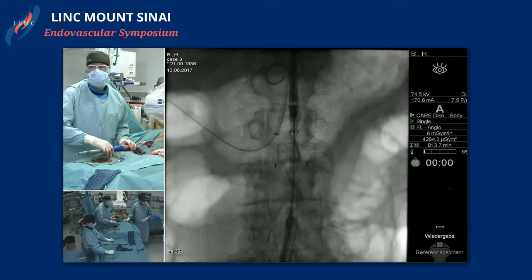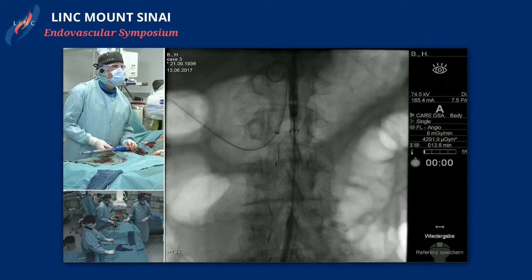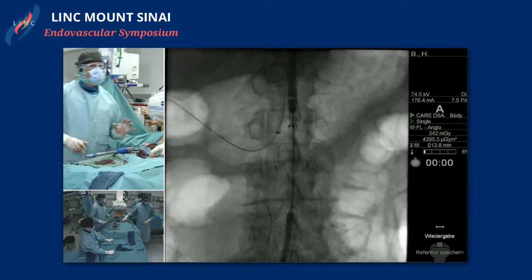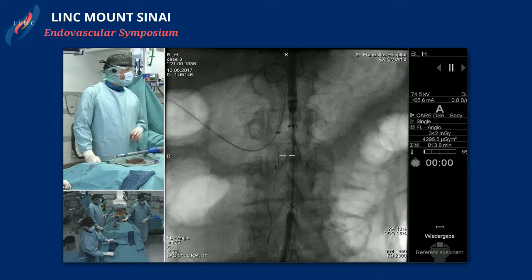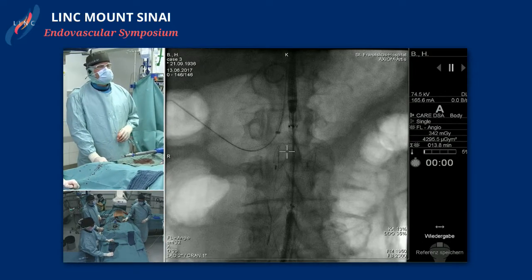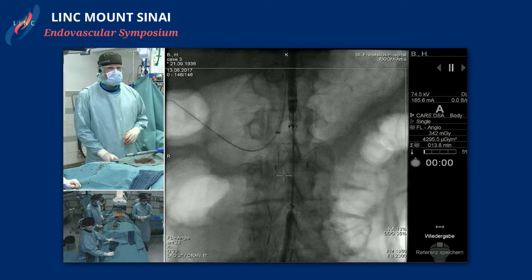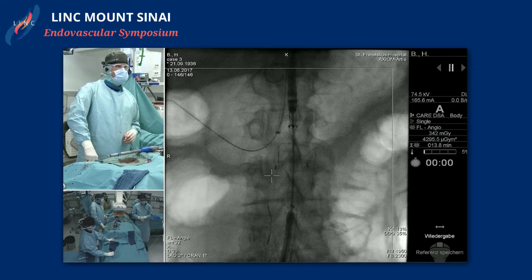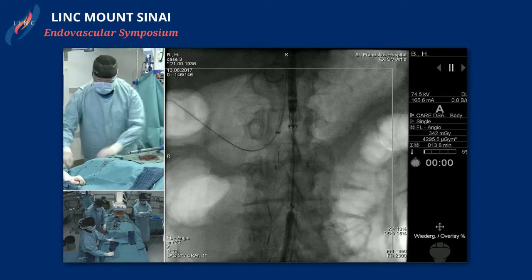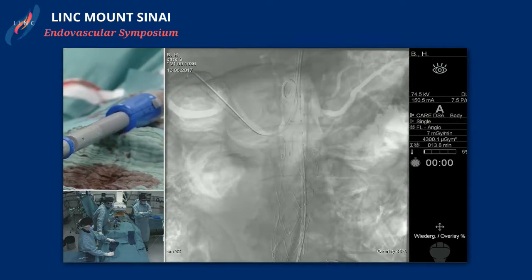Okay, I have just one eye on the fusion. I think maybe here we are in a sometimes good position. I drive my C-arm into a position where we had an angio made before. I just do an overlay. Yes, not bad.